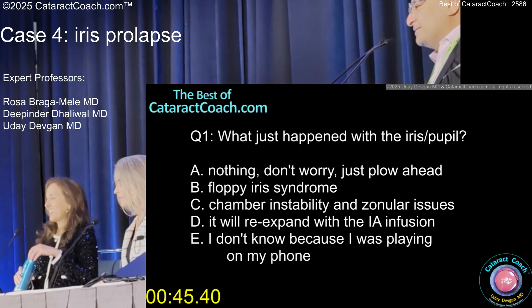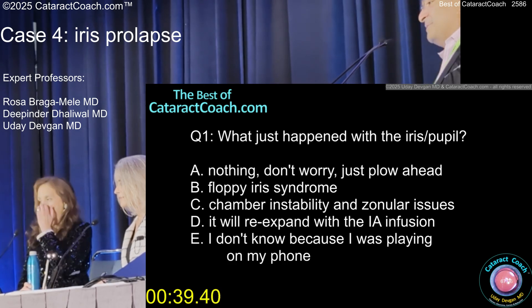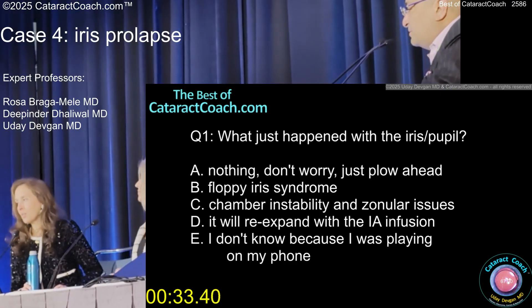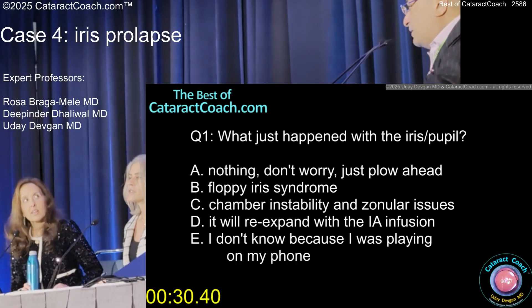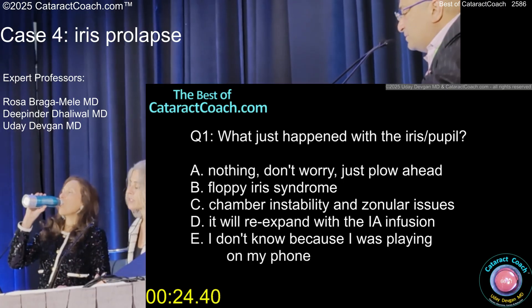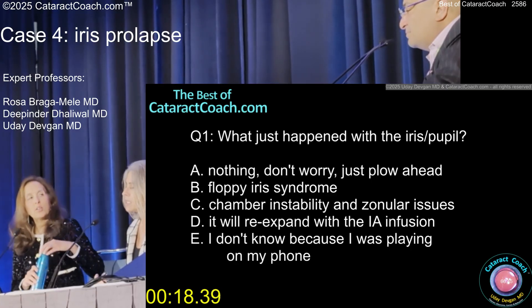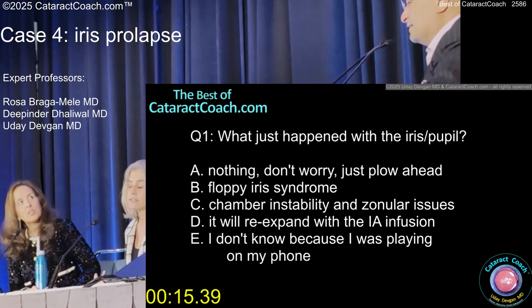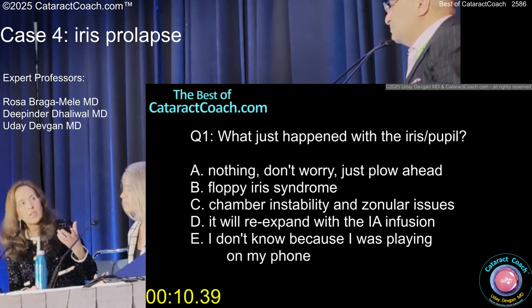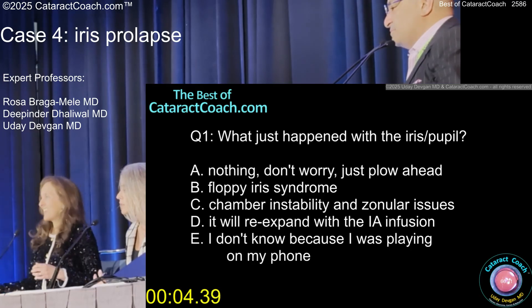I don't know. What do you guys want to do here? There certainly was chamber instability and some possible zonular issues. It's just a little floppy — I wouldn't do anything right now. But it really came down. So I would inject intracameral phenylephrine at this point, with maybe a little bit more lidocaine or BSS to dilute it and see what happens. It could be floppy iris, but it could be zonular issues.